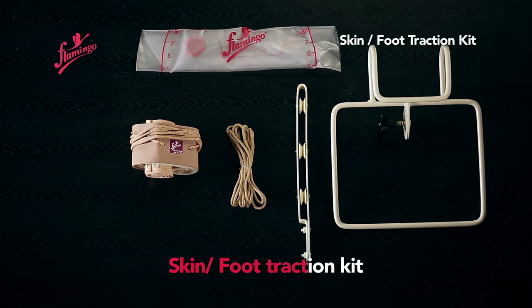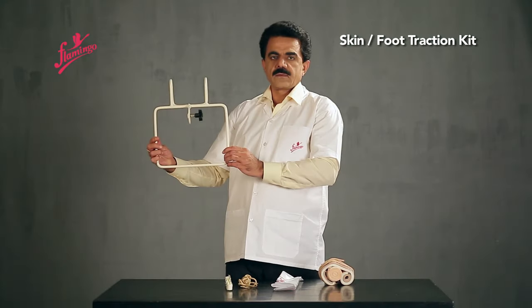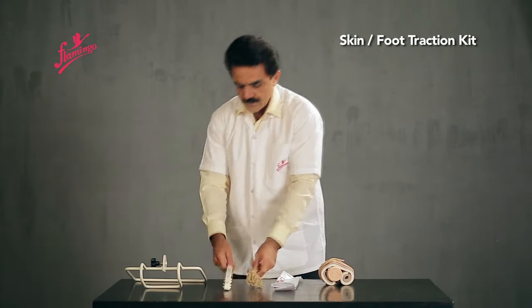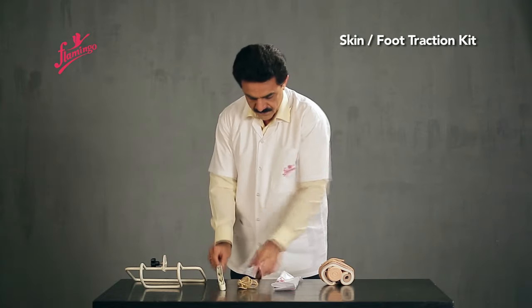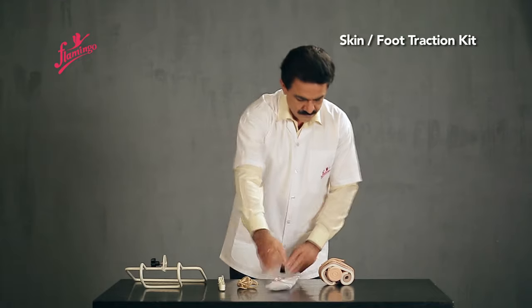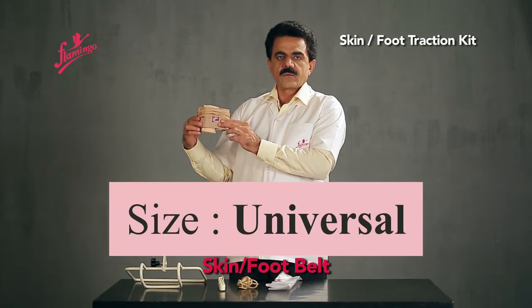Skin Foot Traction Kit. The kit includes the following components: Traction Pulley Bracket, Traction Cord, Water Weight Bag, and Skin Foot Belt.